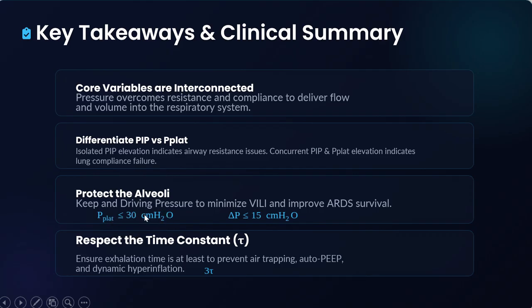Protect the alveoli. Keep the driving pressure low to minimize ventilator-induced lung injury and improve ARDS survival. Plateau pressure must be equal to or less than 30. Driving pressure less than or equal to 15. Respect the time constant: allow 3 time constants to prevent air trapping, auto-PEEP, and dynamic hyperinflation.